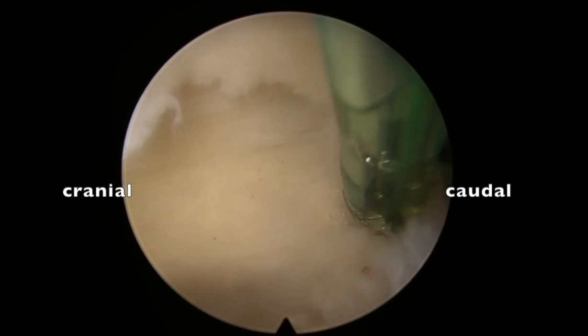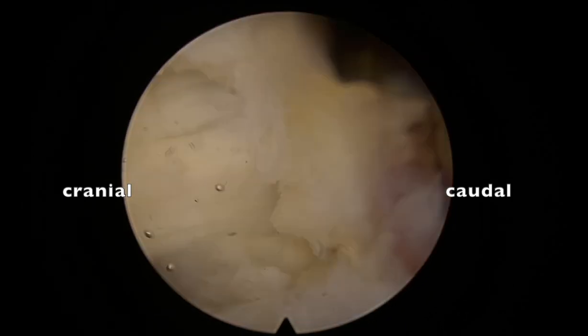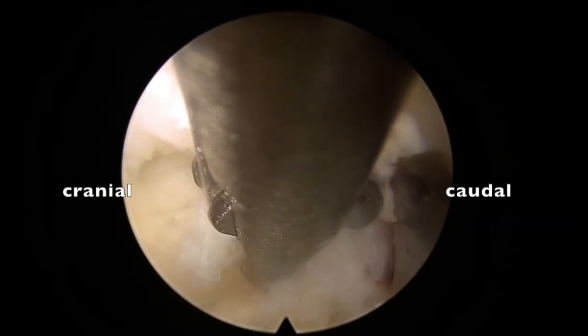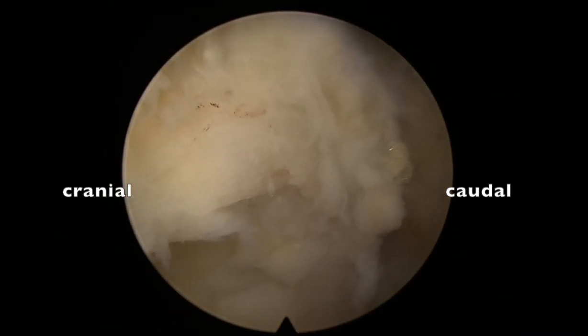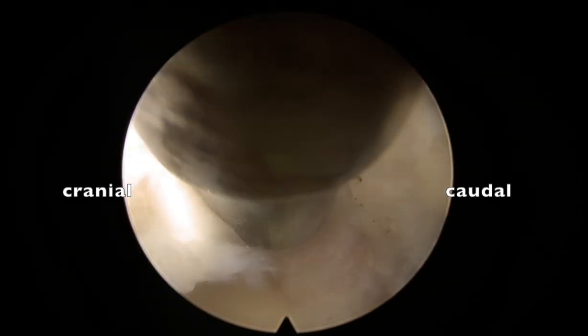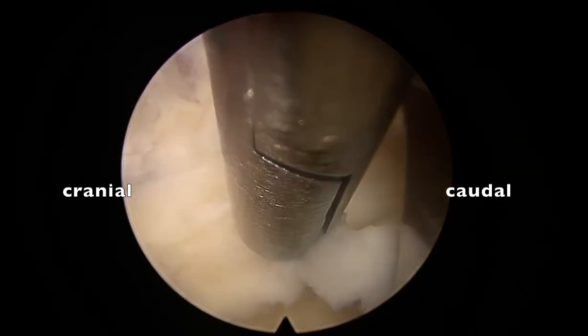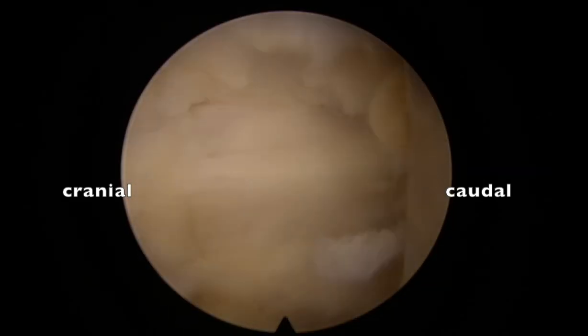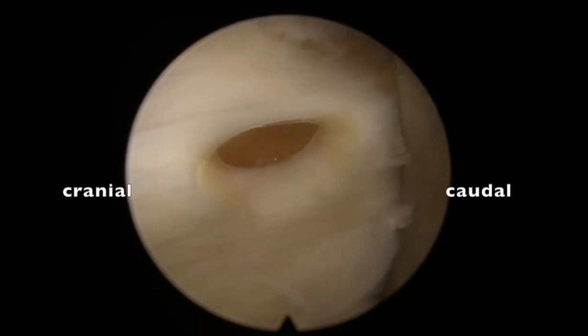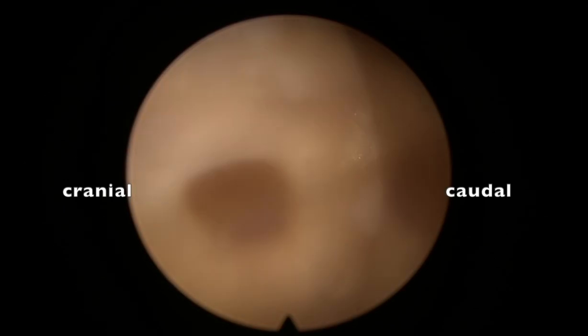Entering the spinal canal is easy, and later, once we open the ligament, seeing the thecal sac and doing our disc work will be easy if we remove the ligament partially. I'm removing the yellow ligament here, and now it is nicely thinned out. Using a small punch or cutter, we can just enter the epidural space. You can see the epidural fat nicely.